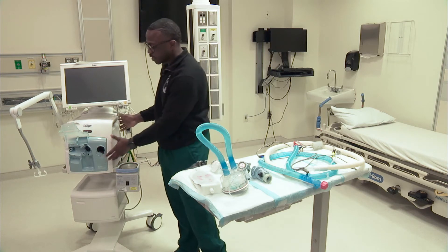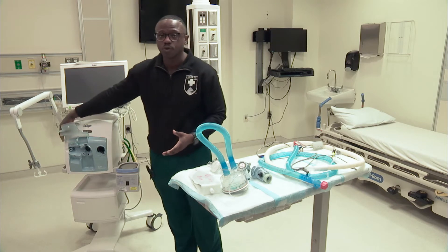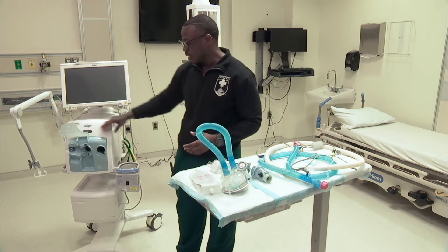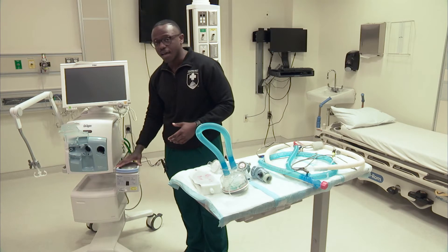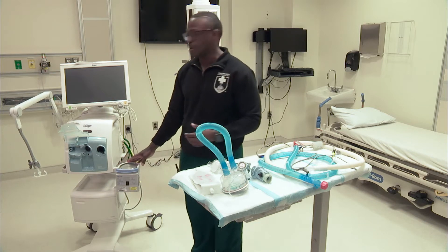This portion of the ventilator right here, you have your inspiration port and an expiration port, and there's also a place for a flow sensor. And then also externally, we have a heater where we can ensure that we have active heated humidification going to our intubated patients.